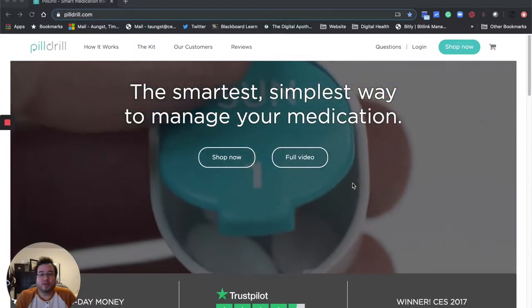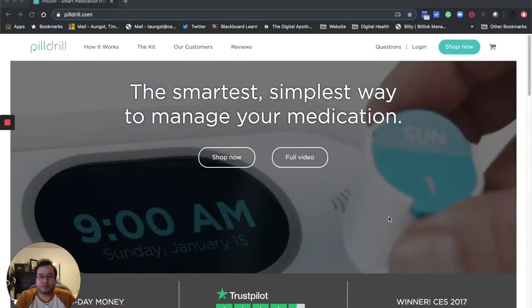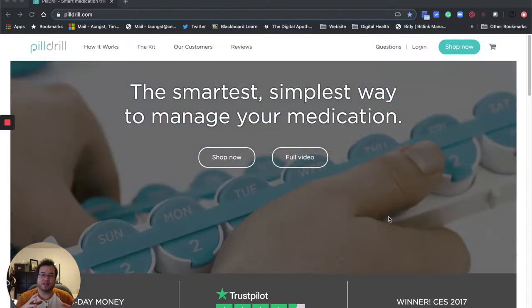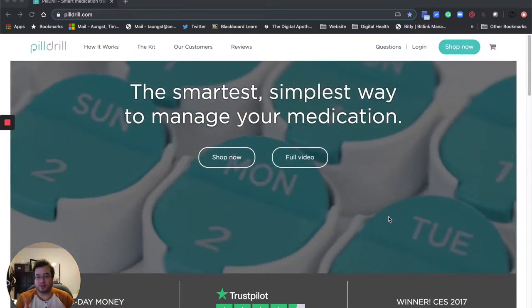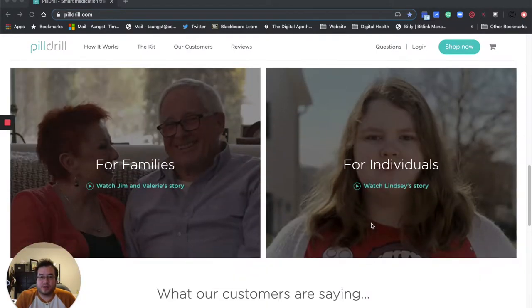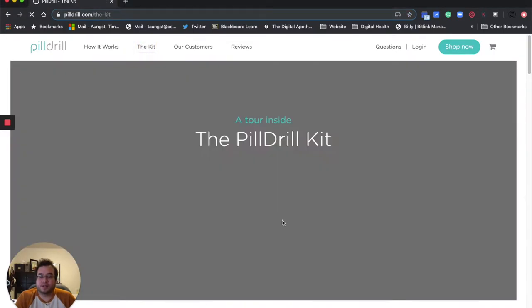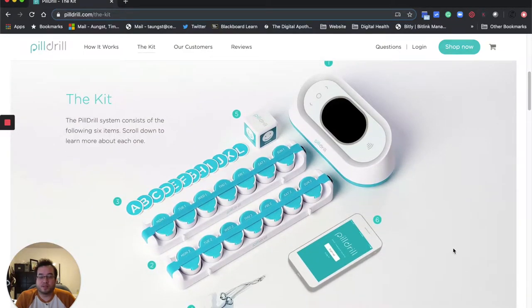So this one's called Pill Drill, and basically it's an interesting platform. What it is is they have this hub that you use as a central place where you then scan medications to tell yourself that you took them. It's quite interesting how it all works. I watched a video — it's good to see a rundown of what it does. Now I'll go to the kit, talk about some of the different parts, and then I'll open the box up and show you. What it comes with is all these different materials.